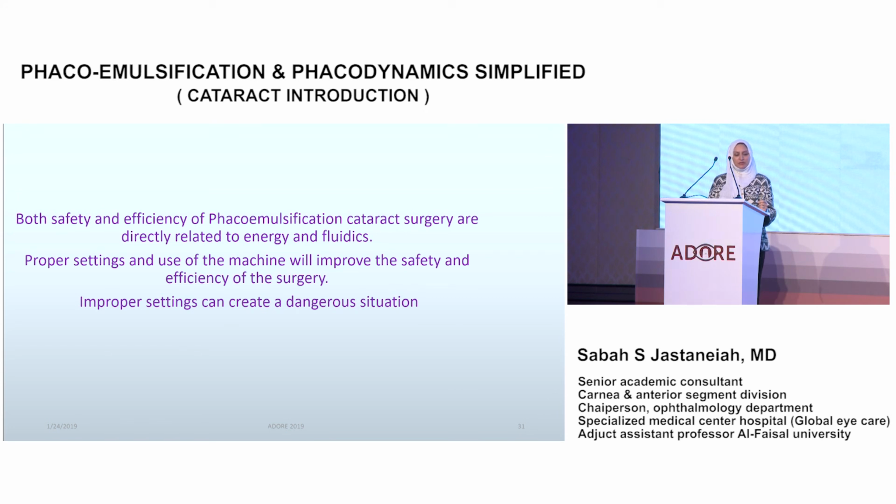So both the safety and efficacy of phacoemulsification surgery are directly related to the energy, the ultrasonic power, and the fluidics, and the proper setting and use of the machine will improve the safety and efficacy of the surgery. Improper settings can create a dangerous situation. So always imagine that if you have a very strong sports car but don't know how to drive it, it's very dangerous. Thank you very much.